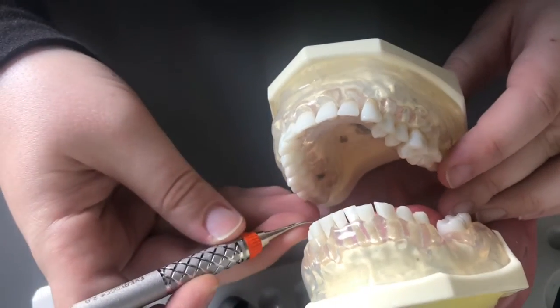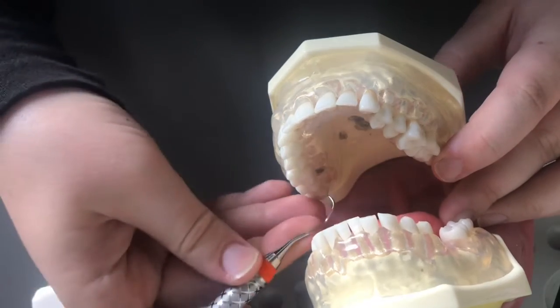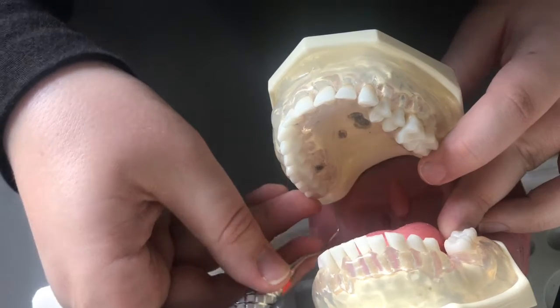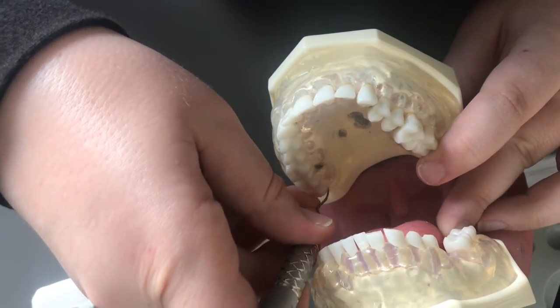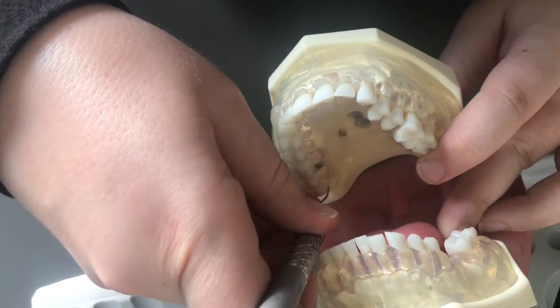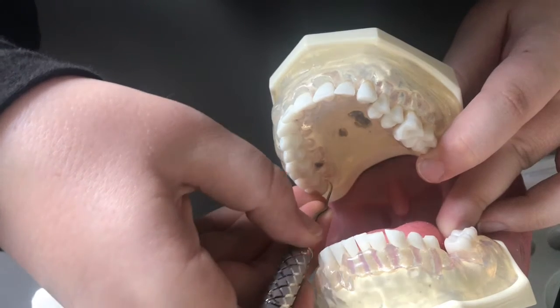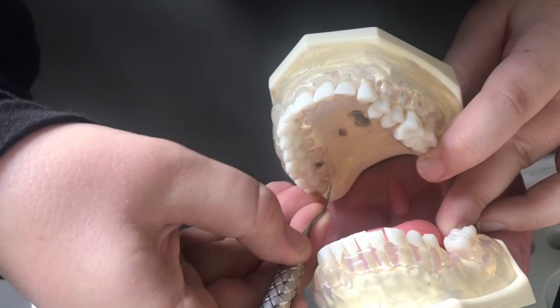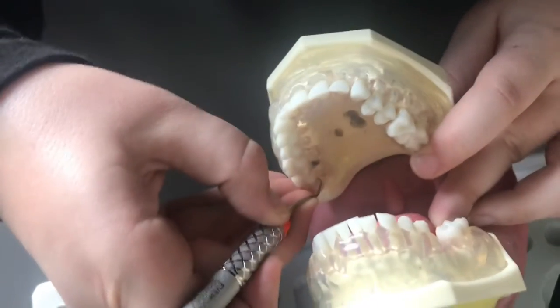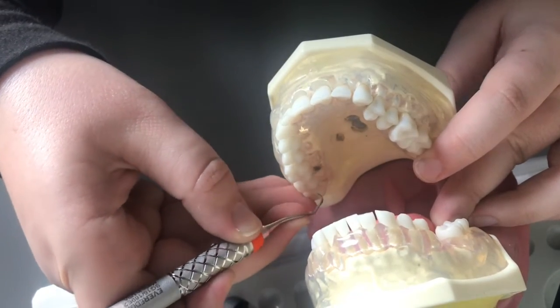Here we go. So I want the V of my instrument to be pointed towards the distal, V to the D. And hopefully that can be seen. I'm going to start back a little behind the distolingual line angle and turn into that interproximal area with my terminal shank as parallel with the tooth as possible.